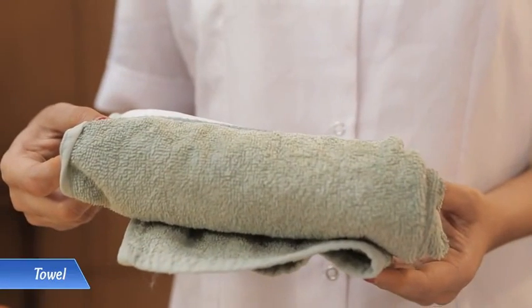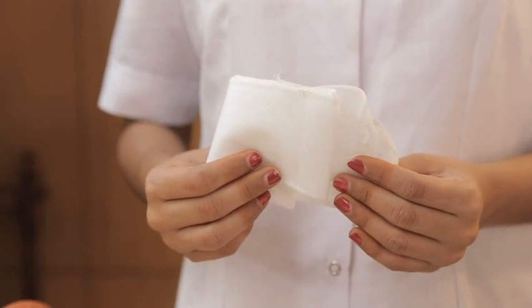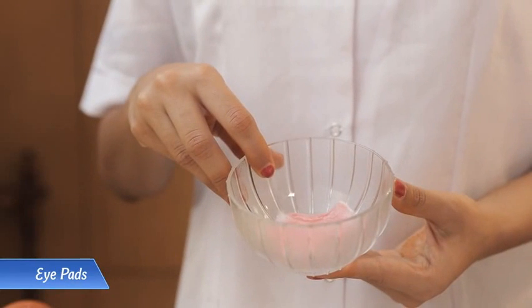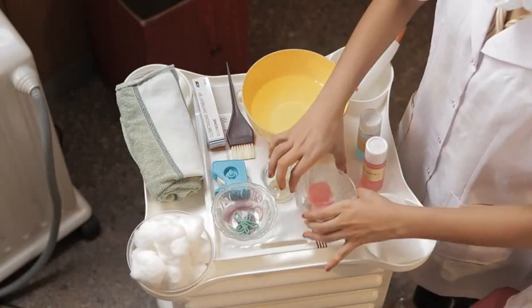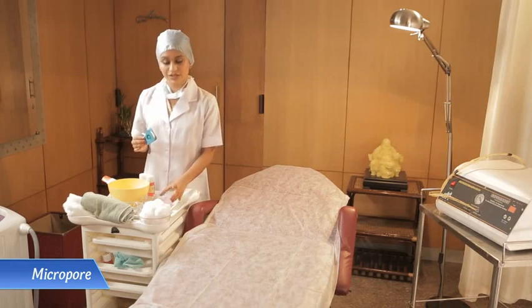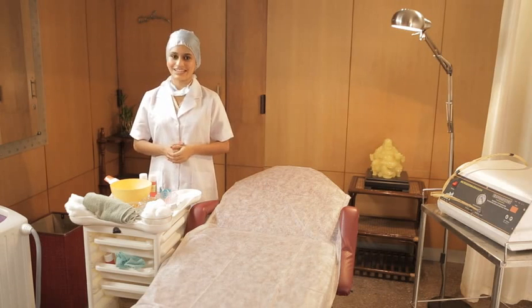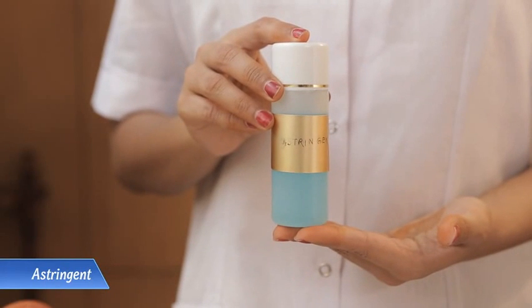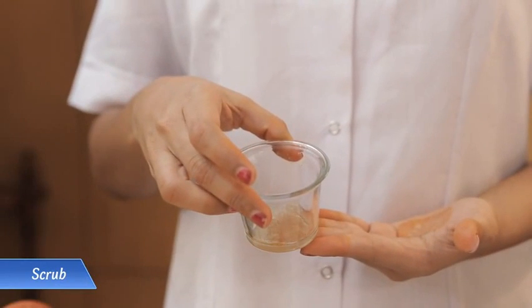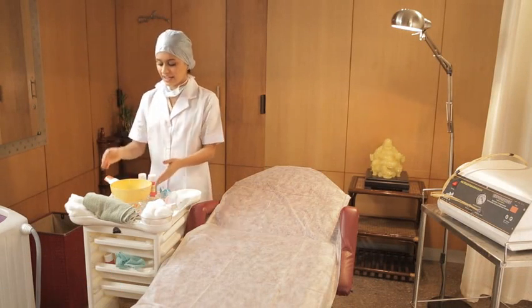Here's the towel and the hairband. These are the cotton pads that are soaked in rose water — these will be used as eye pads. This here is a sticky plastic called micropore, it is used to secure these eye pads firmly on the eye. And now the things I will need to cleanse and scrub the skin: astringent, mild scrub, cotton balls, and lukewarm water.